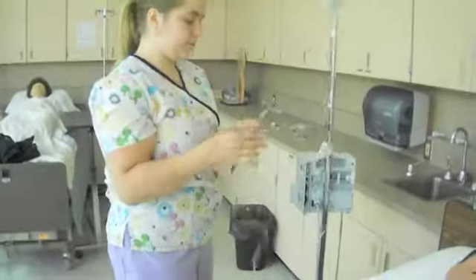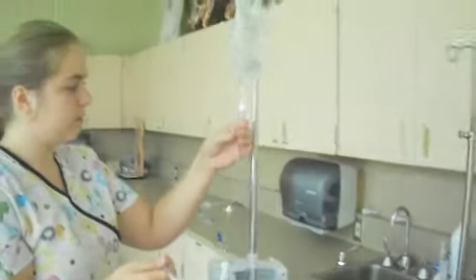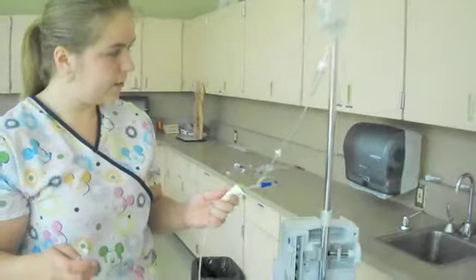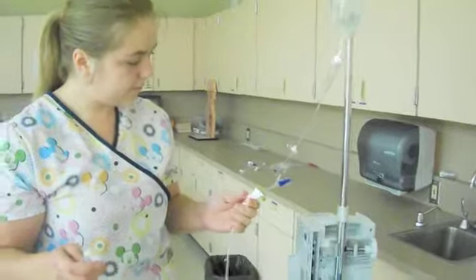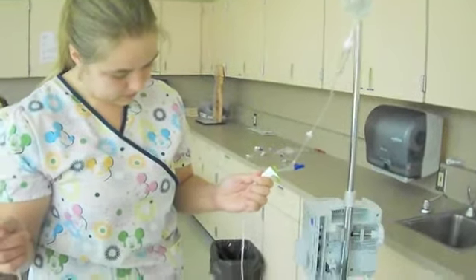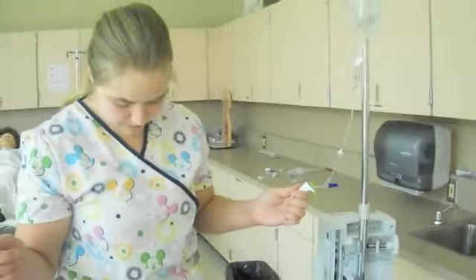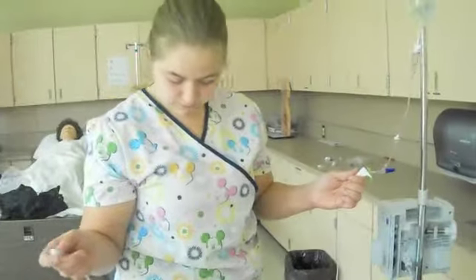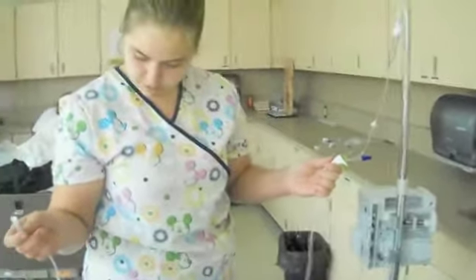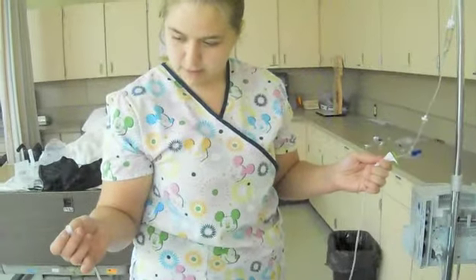We're going to fill that drip chamber halfway with the fluid, and then we're just going to flush the line. Make sure you go fast enough — you don't want to take all day, but you don't want to get any air bubbles. Just wait for it to go through the line. Okay, and we are at the end.